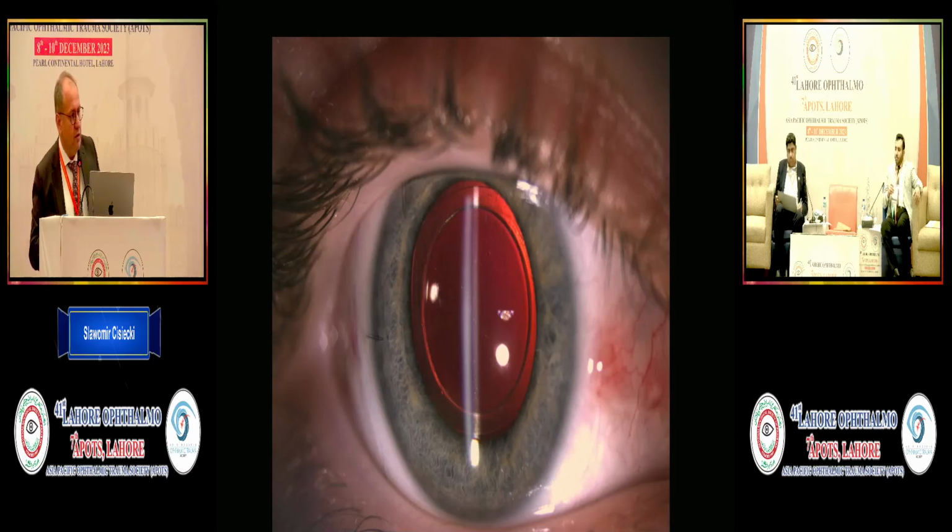We suture not only because they have to be watertight, but also because we have to do everything to help these kids. Otherwise, if we lose the eye because we didn't do something we should have, it's unbearable.